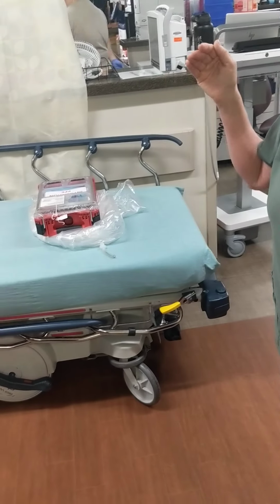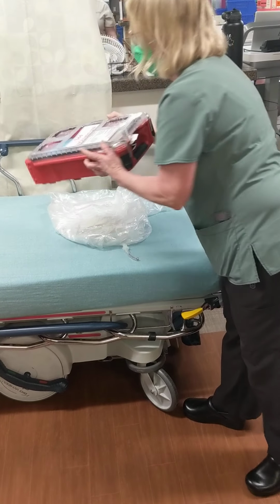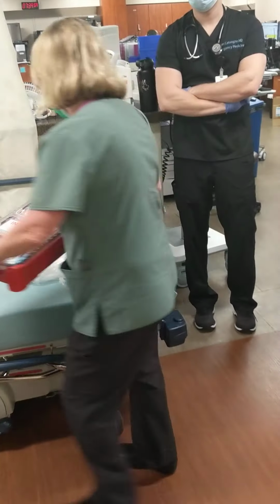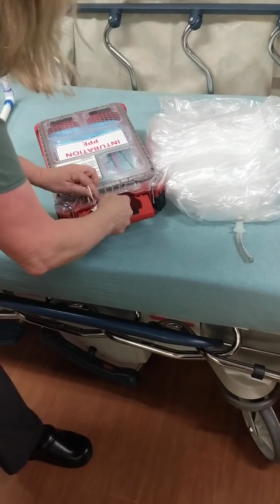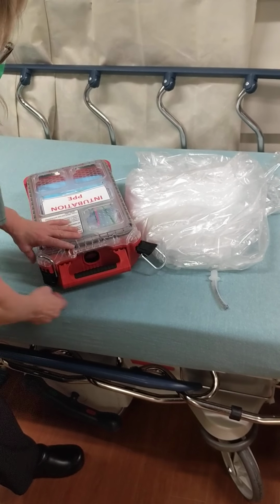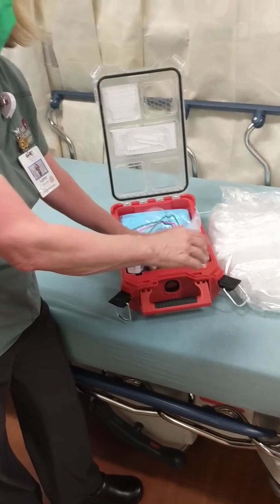As we decide to intubate, we're going to come out and grab our peripheral staff. We'll tell the tech, I need the glide scope and I need the frame. We have a PPE intubation kit on top of the carts outside of rooms 3 and 4. In this box is an N95 mask for everybody, the plastic cover for the bed, eye protection, and a gown. And there's a cover for the glide scope.